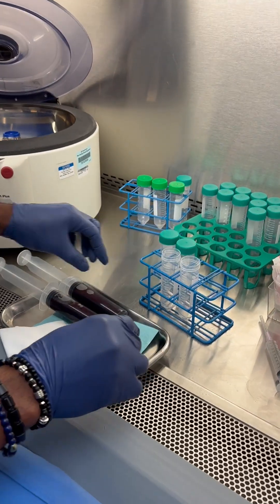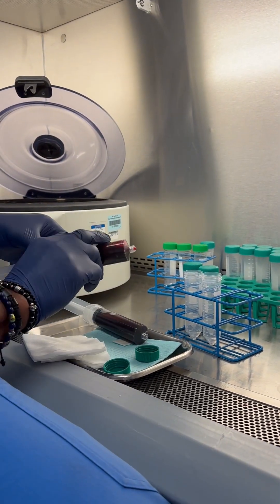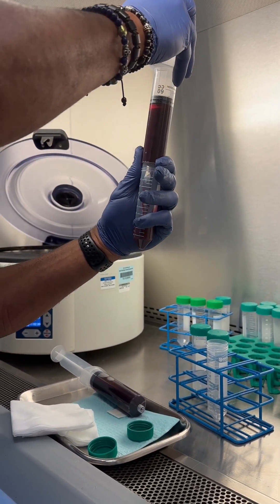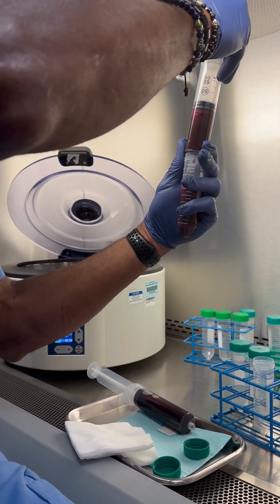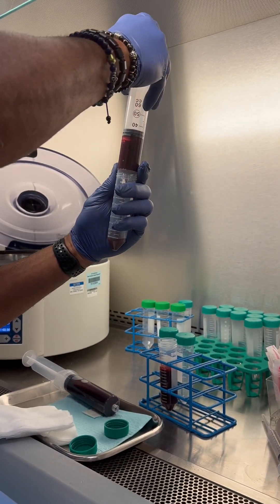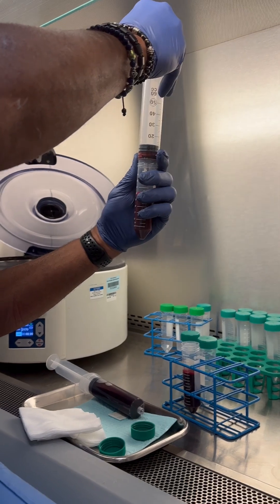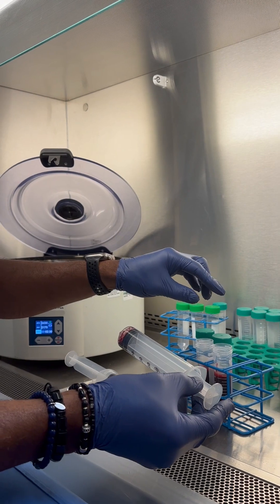These are sterile 50-milliliter test tubes. For this patient, we drew 120cc of blood. We never put more than 30cc in — we've done tests putting in 45 or even 60cc and the results come out different. So that's 30cc there, with nothing added other than the ACDA that was already in the syringe for the blood draw. That's 30cc twice, so they match.